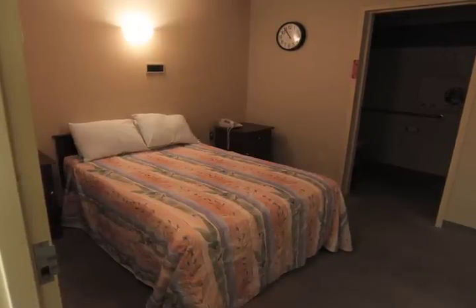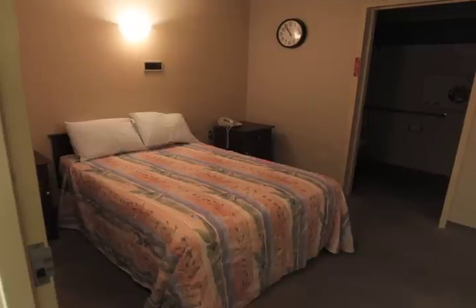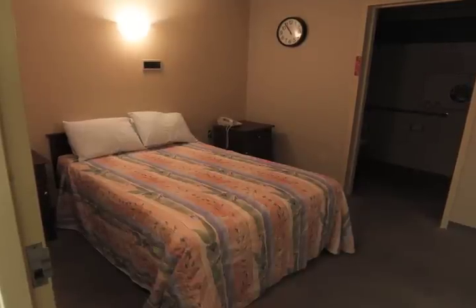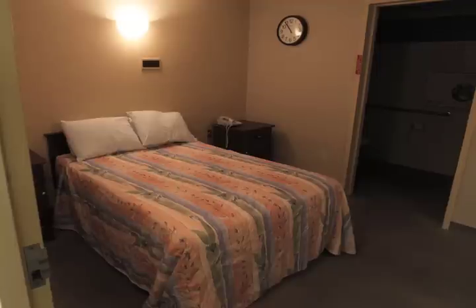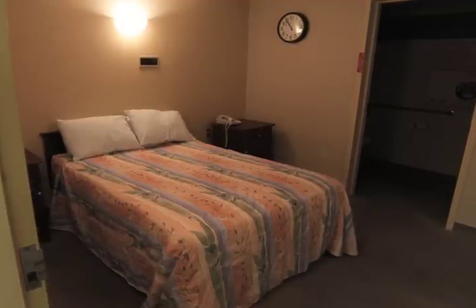In this situation, the baby will sleep in his or her own crib or bassinet and still be hooked up to the central monitoring system. This system is monitored from inside of the NICU. Parents provide all care for their infant and a nurse is available to them if a problem should arise.